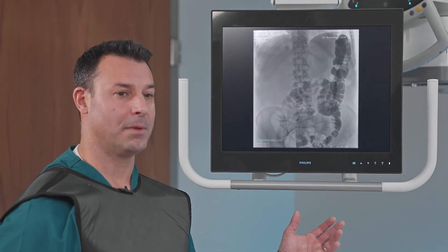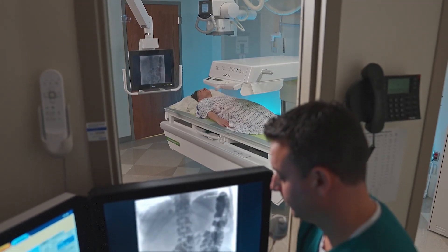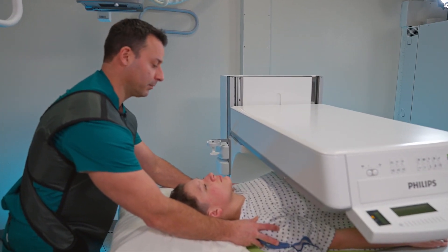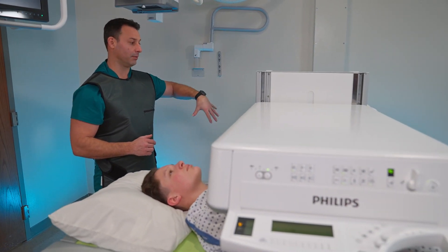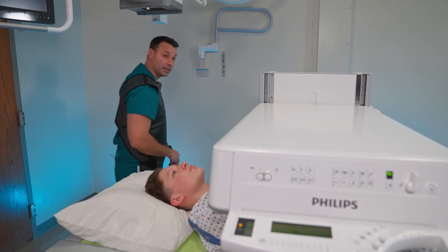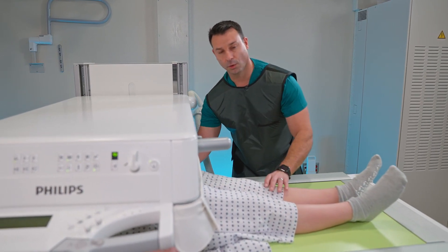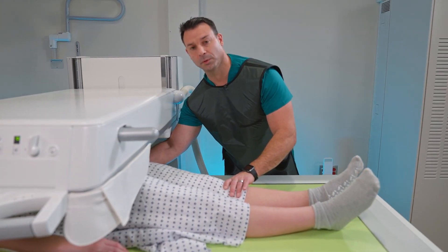We also have the in-room overhead monitor, which can be moved around the room, and you have the images displayed to show the patient in the room as well. I can come into the head end of the patient and position from up here. If I need to access the other side, I can easily do that because there are no large motors on the back side and there's a small footprint. I can easily walk to the foot end of the table, manipulate the patient, or stand by a pediatric patient during the whole procedure.